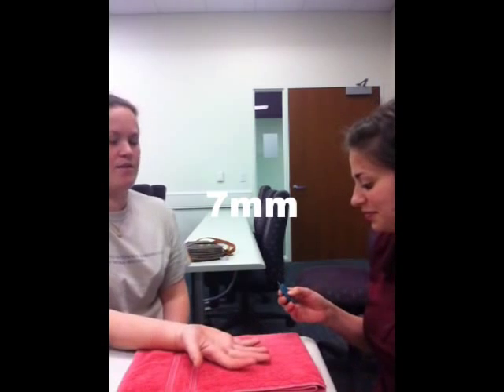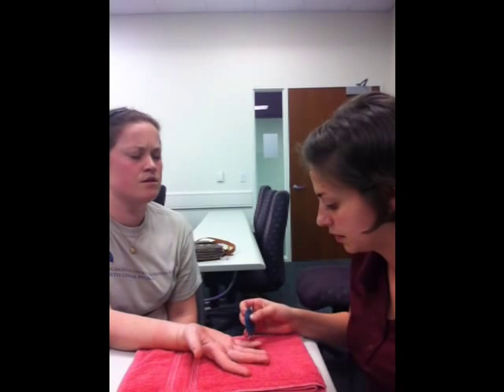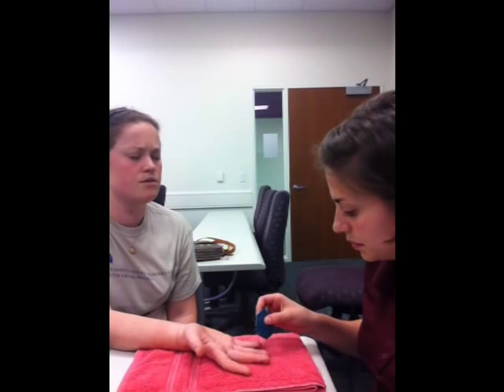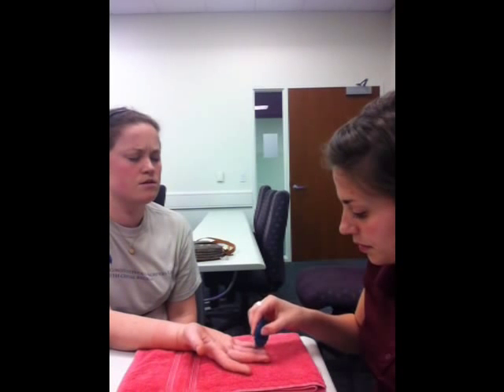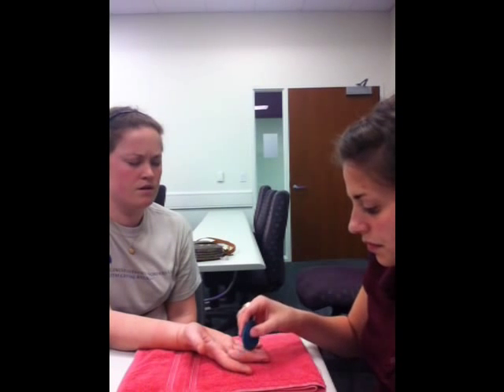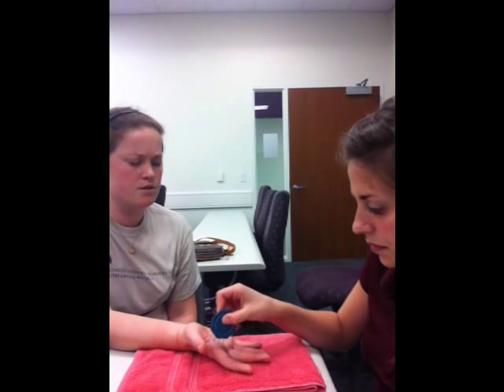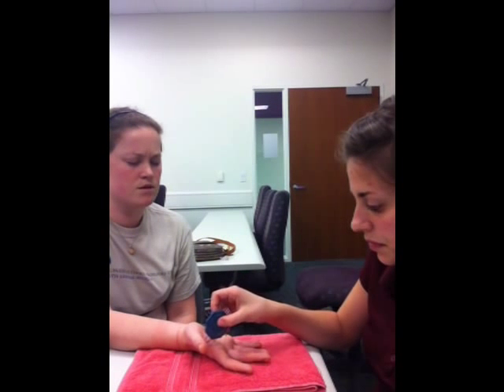Okay, great. So we were able to distinguish at that side, so we're going to move down. And do the same thing. Two, one, two, one, one, one, two, one, two, two. One. One, two, one, one, one, two, two, two, two, one, two, two, two.